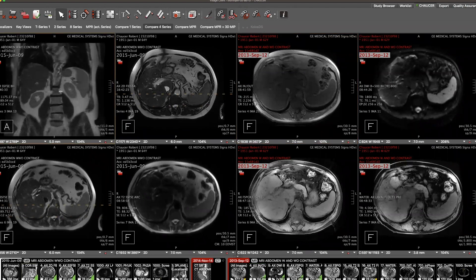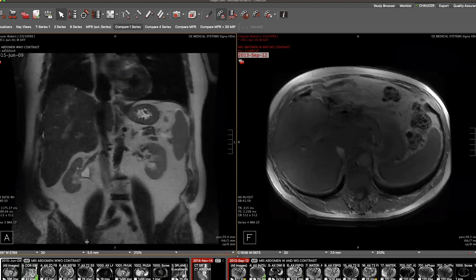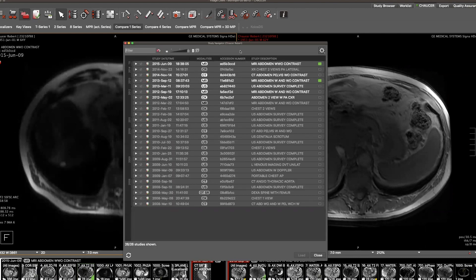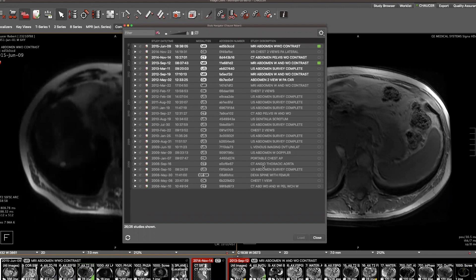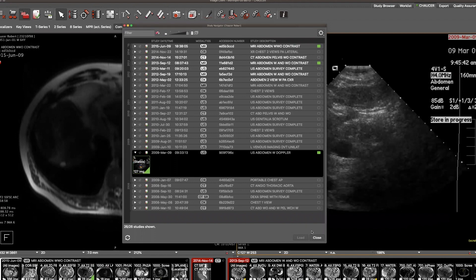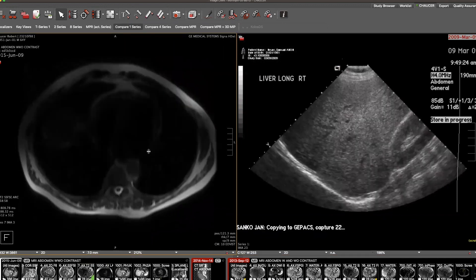I also note that I have scout lines active by default. So as I scroll through my coronal sequence, my scout lines are positioned on my axial images. I can step from any one of these to an additional compare one-series layout and even drag a different series up into a viewer. I also have available to me at any given point my entire patient jacket, and from here I can load studies either in their entirety, or in this case I may want to just bring in an ultrasound into the display on the right. Then we'll close the navigator and view the ultrasound alongside my current MR sequence.